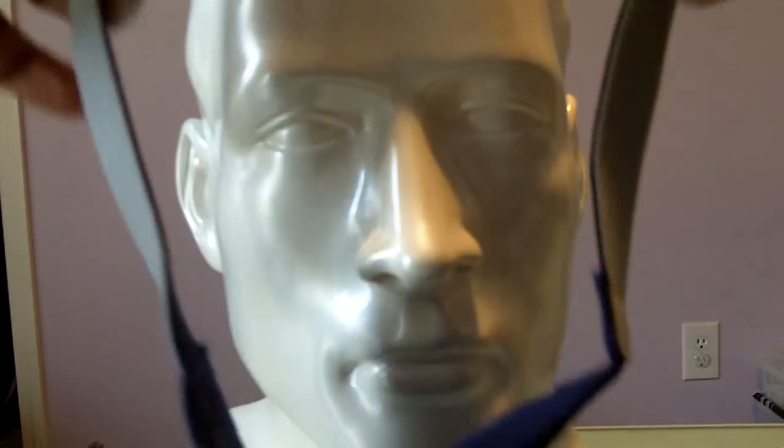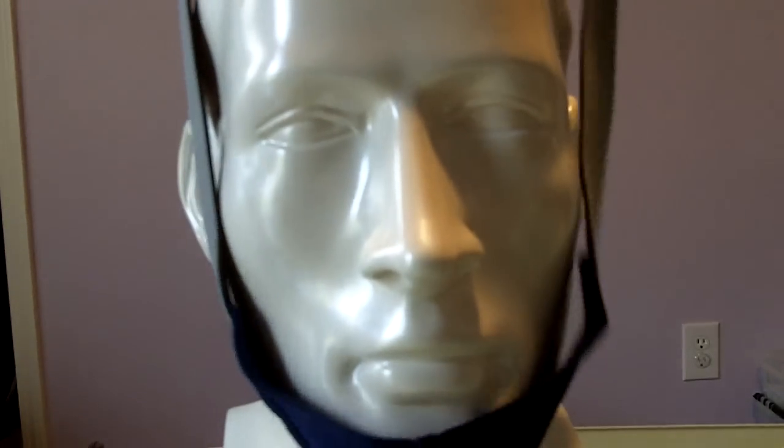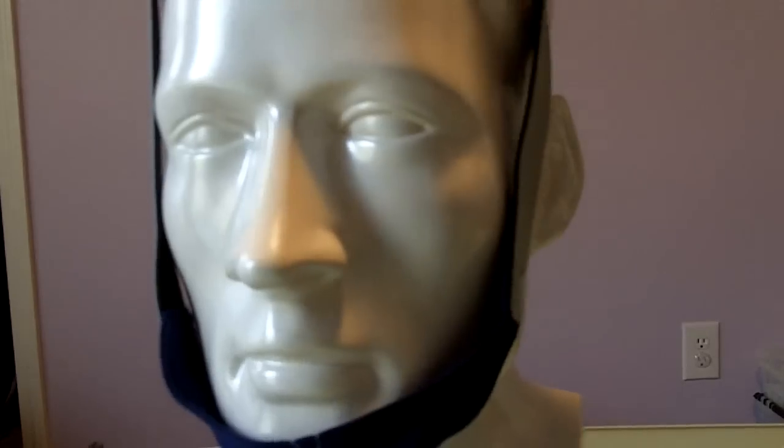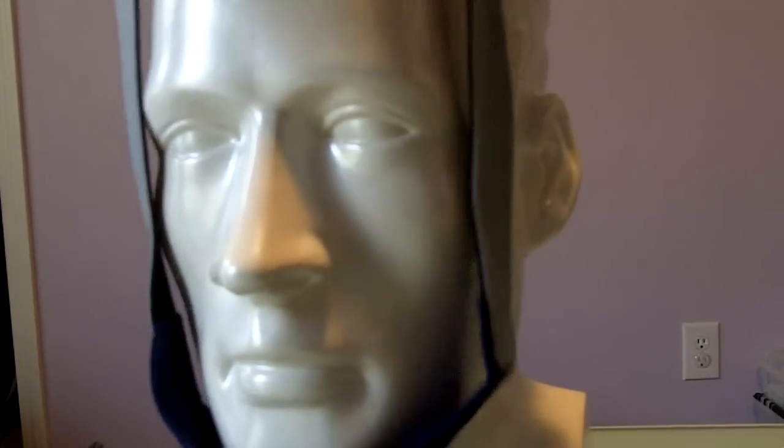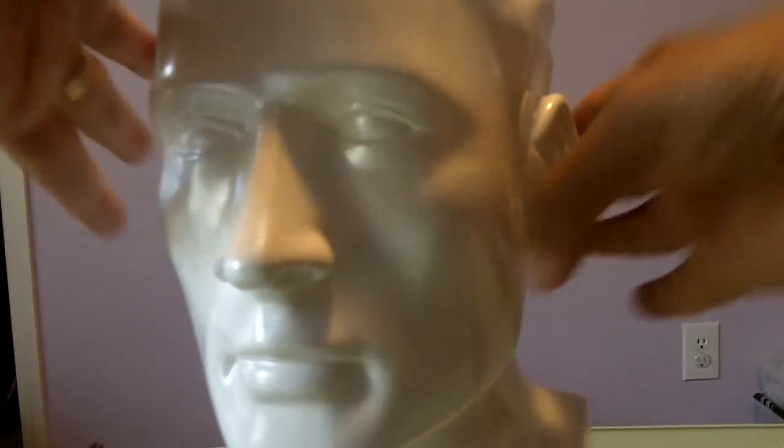If you have severe jaw drop, meaning when you sleep and your mouth really opens up really wide, this chin strap will not do. The ResMed chin strap will not do. There are other types.